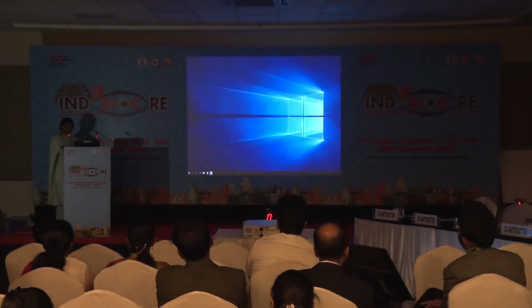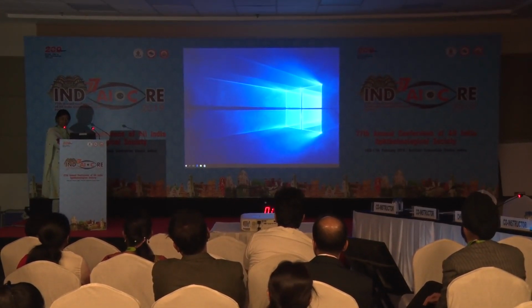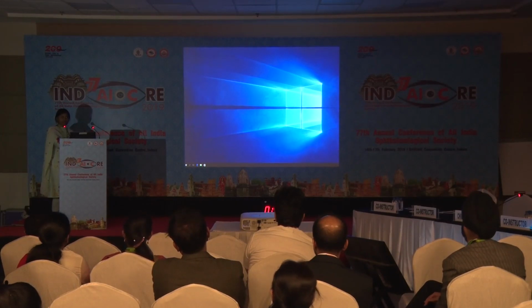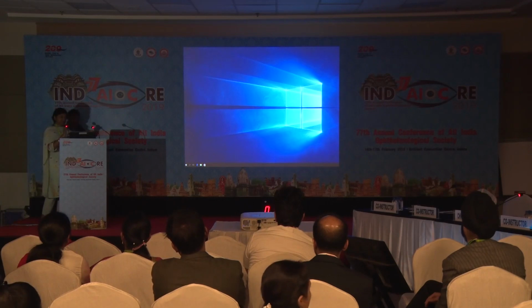So in traumatic cataract, there can be a lot of surprises on the table. So that's why you need to always be open to the fact that sometimes we may need to put an iris fixation lens, or we may think that there is enough support, but then we may need to do a scleral fixated or an iris fixated lens. So proper planning is essential. Sometimes the pupil may not dilate as well. So on the table we may be having some difficulty in stabilizing the lens.